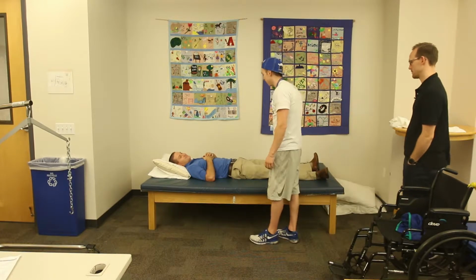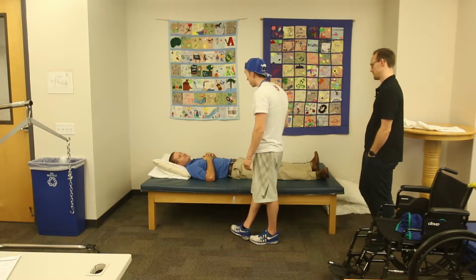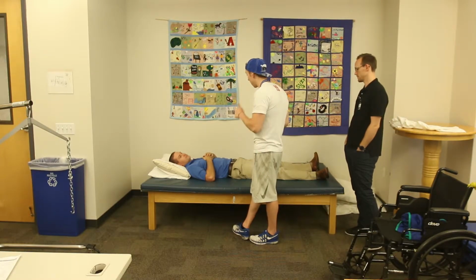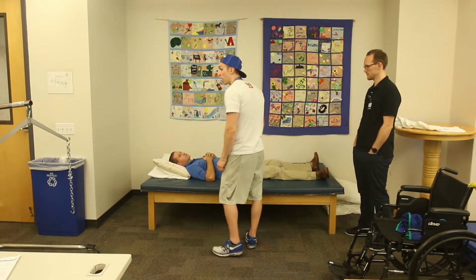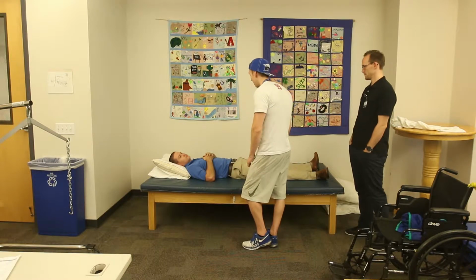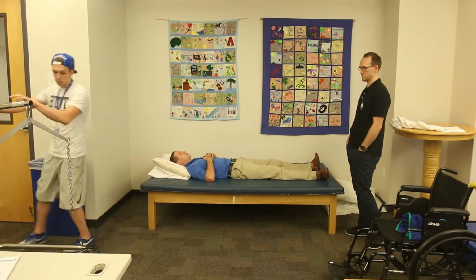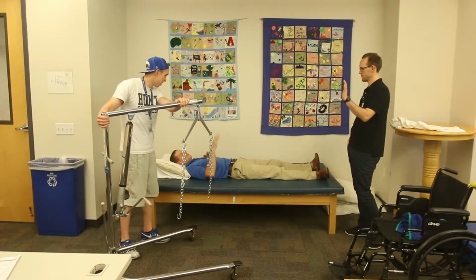Dylan, how's it going? Good. How are you? Good. Feeling good today? I think so. Awesome. My name is Jared. I'm a student physical therapist. We're going to get you up out of bed here. We're going to set you in this wheelchair. But in order to do that, we're going to use what's called a hydraulic lift. Mostly just means you're going to go for a free little ride. And mostly you're going to sit back and relax. Okay. But we're gonna set up a few of those things first, so you can just hang tight, okay? Okay, thank you. We'll just bring the hydraulic lift in. By the way, this is Lucas. He's gonna be helping out today.